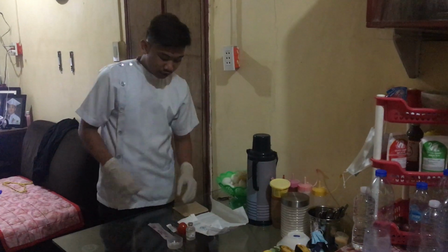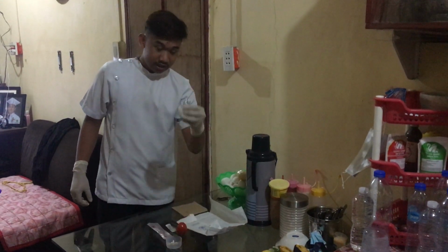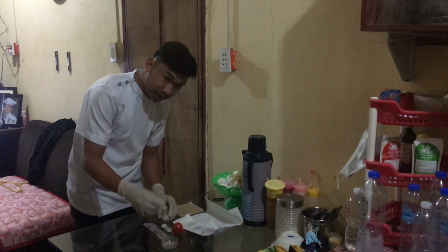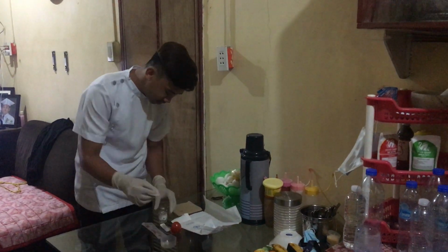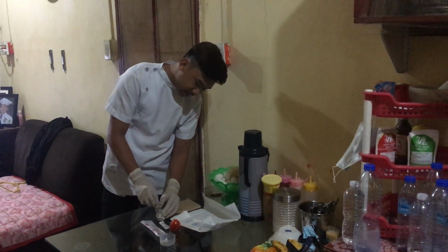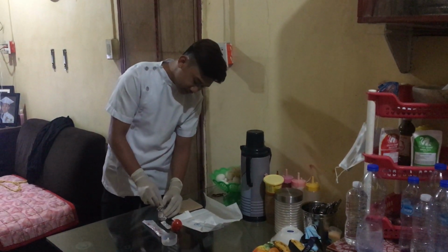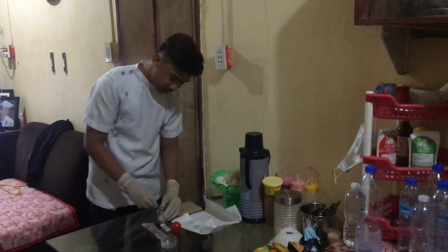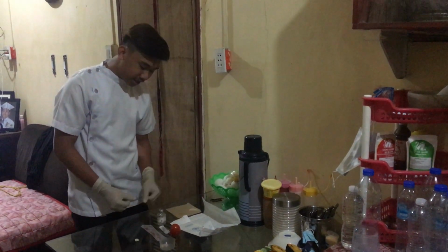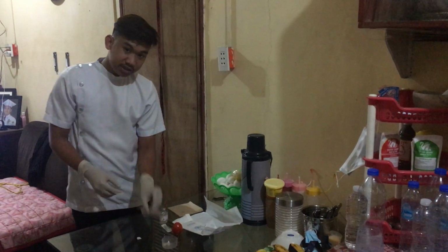Then next, I'm going to get the medicine or the insulin. Then I'm going to get a wet cotton ball and rub the rubber cap of the vial, inner to outer, and then I'm going to let it dry, and then I'm going to get the syringe.